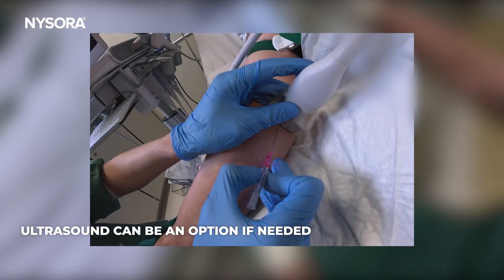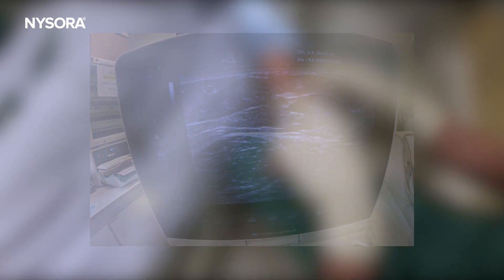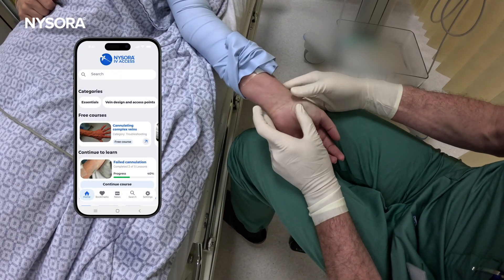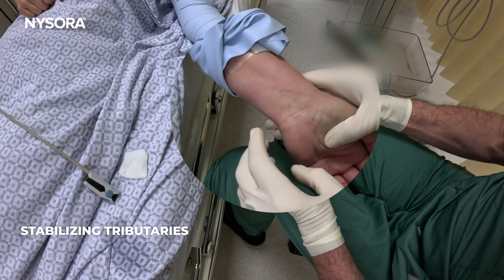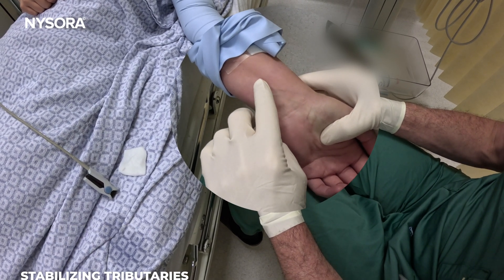Ultrasound is always an option for deeper veins, but sometimes for quick and easy, this may be just faster. With this particular vein, what's good about it is it has two tributaries, so it kind of stabilizes it, and it fills pretty well.